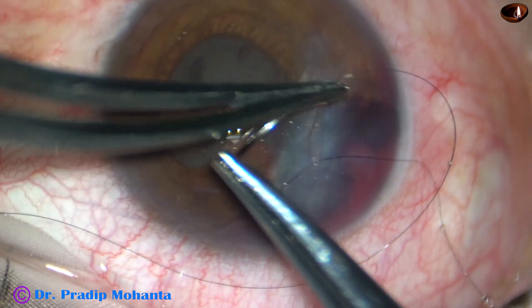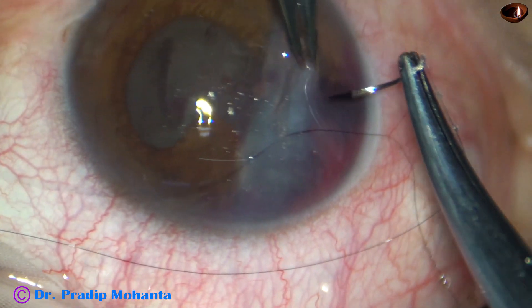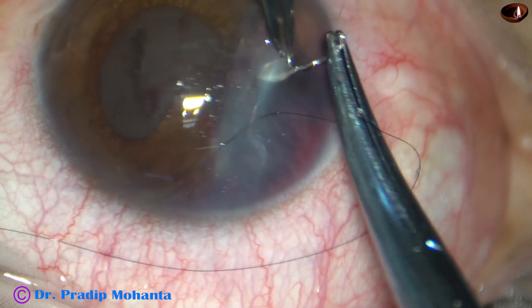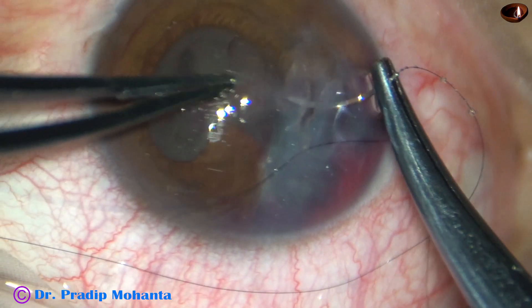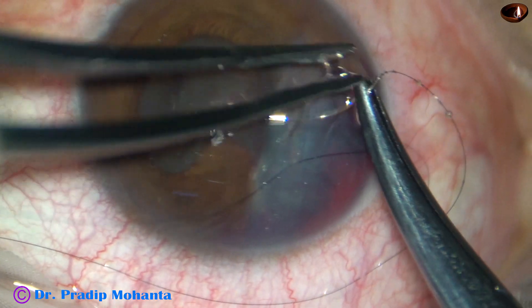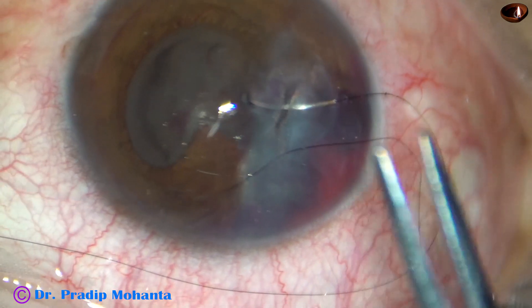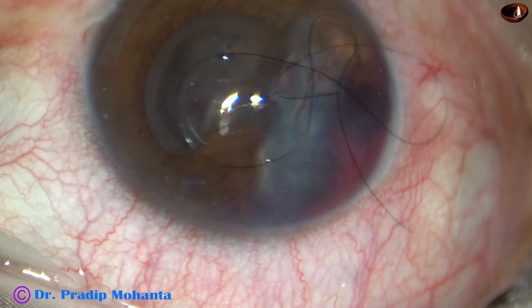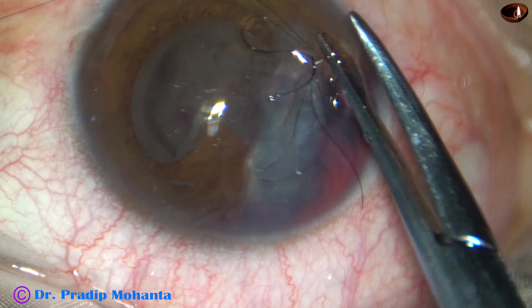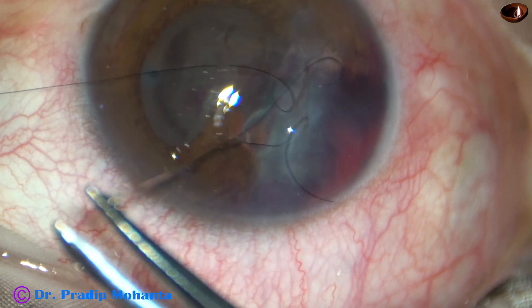So this is going to be a continuous shoelace suture. I have taken the first bite from the wound to the left leaf of the wound, and this is the second bite. The bites are being taken at a depth of about 70–90% of the thickness of the cornea. Two bites are taken such that one more bite can be accommodated in between when it comes back — this is the continuous shoelace suture.